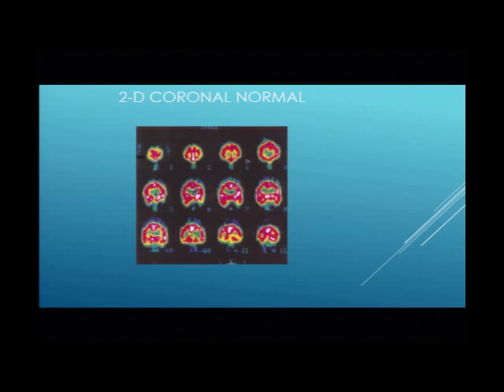Now these are slices from the front to the back. Here's the front where the brain is smaller, and as you start going back, it gets bigger and bigger. When you get to the middle of the brain, you have these other big structures here. You see it's white. It's at the top of the scale, so that's great. On the abnormal ones, you're going to see these better. These things hanging down here, once you get past the first part, are the temporal lobes. Those are the second part of the brain that bears the brunt, because the front of the brain is not fixed, the back of the brain is partially fixed, so the part that's mobile moves more, gets more acceleration, deceleration, more force, and more injury. So there's a gradient, which I'll show you when we get to the abnormal ones.